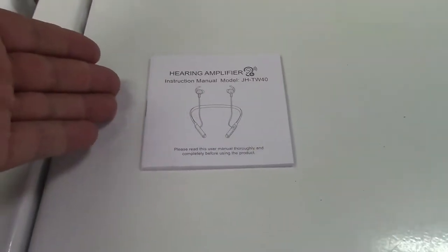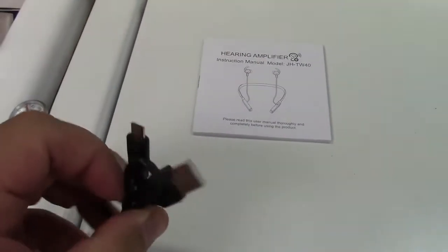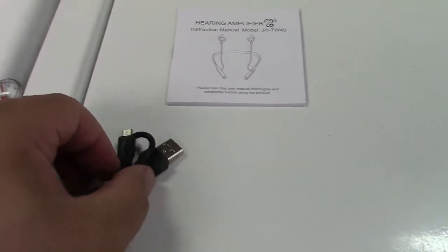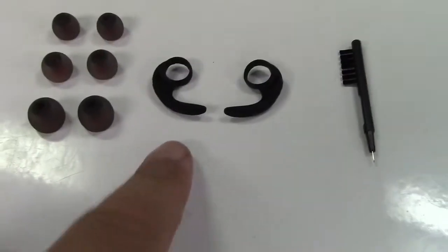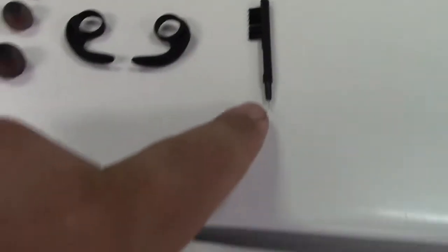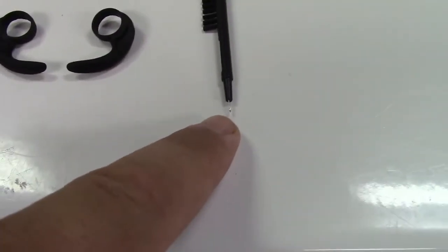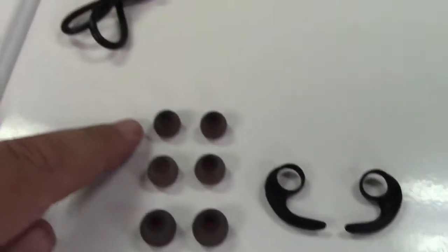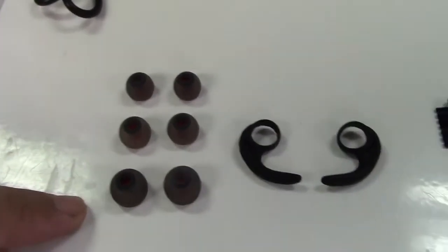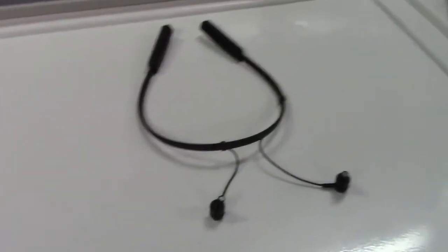In the box you get the instruction manual, charging cable, USB to micro USB. They give you a couple of ear hooks, a cleaning brush with a point at the end, three different size ear caps, and of course the unit itself.